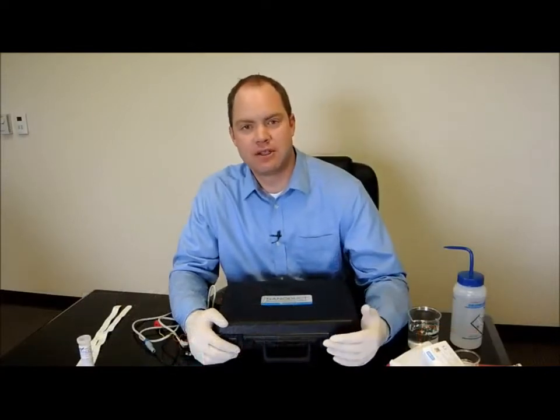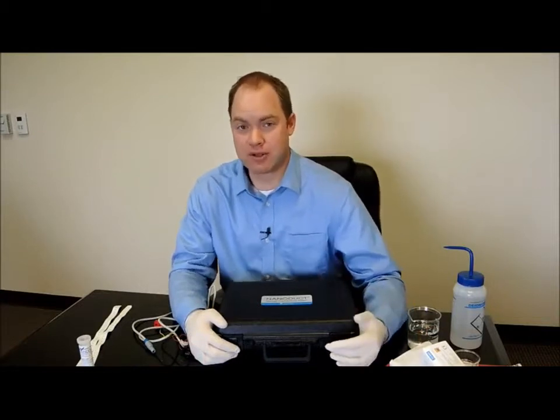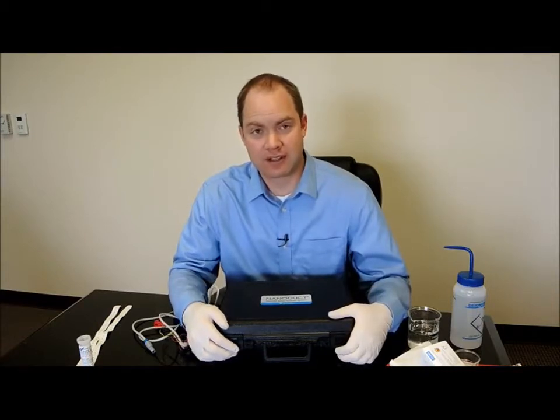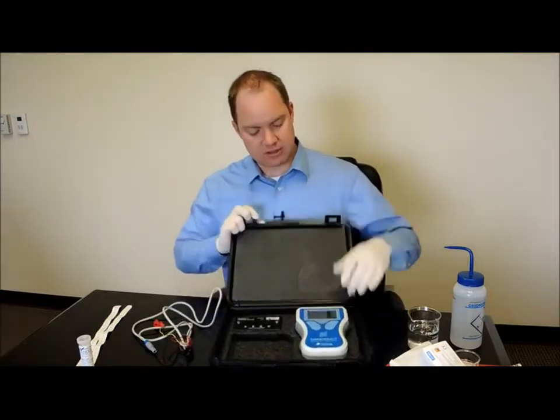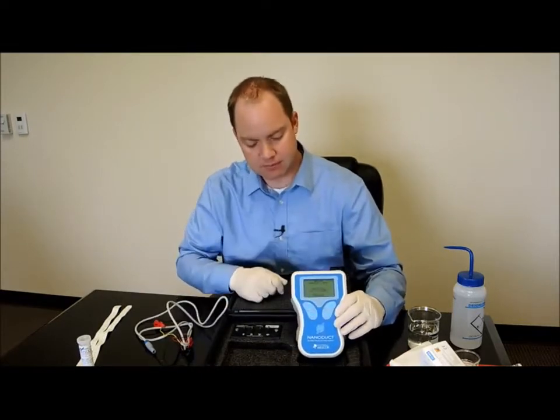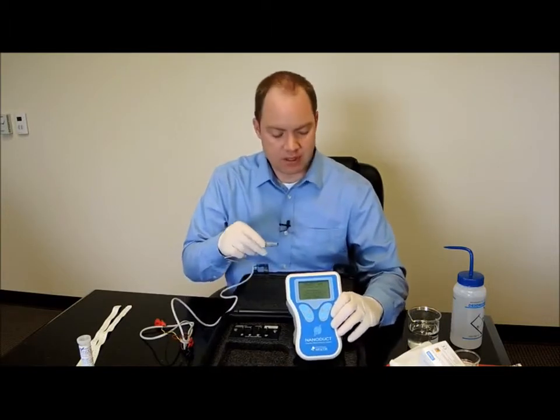Now that I've described to you all the accessories and supplies that you'll need with the Nanoduct, I'll show you the proper use of the Nanoduct. The first thing you do is you calibrate the Nanoduct. So you turn on the Nanoduct by pressing the on button, and it does a software boot up.